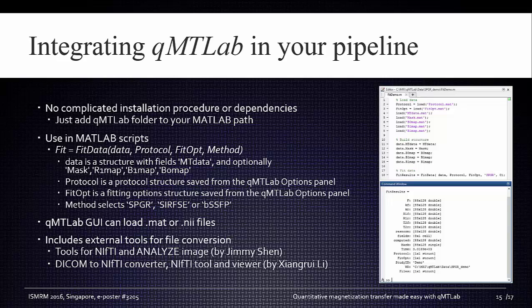Now, how can you integrate qMTLab in your pipeline? It should be fairly straightforward. There are no complicated installation procedures or dependencies. Basically, you just download the software, extract it to a folder somewhere on your computer, and add this folder to your MATLAB path. You can also use qMTLab in MATLAB scripts.